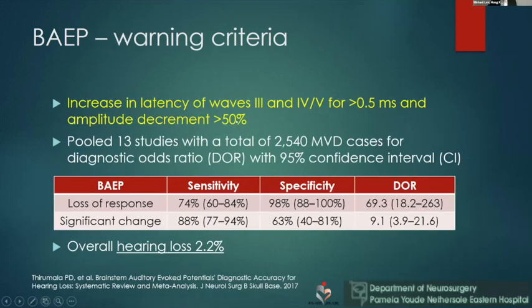So the warning criteria we have: increase in latency of wave 3 and 4 or 5 for more than 0.5 millisecond, and decrease in amplitude by half.